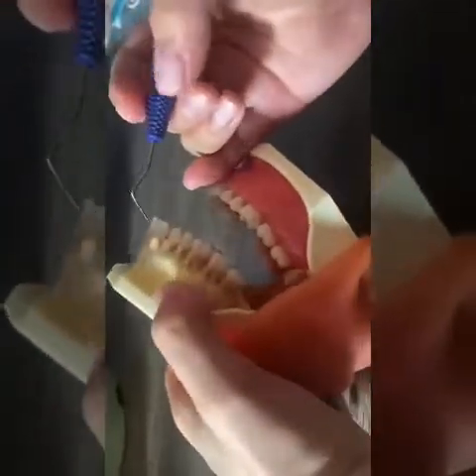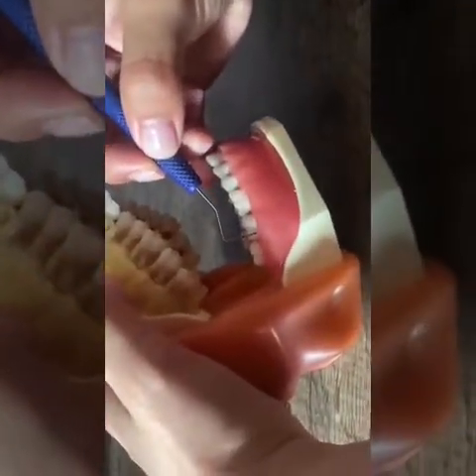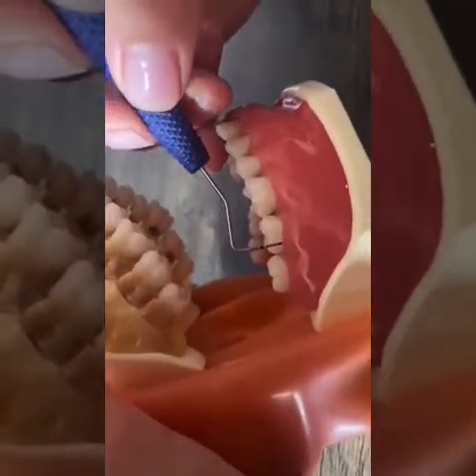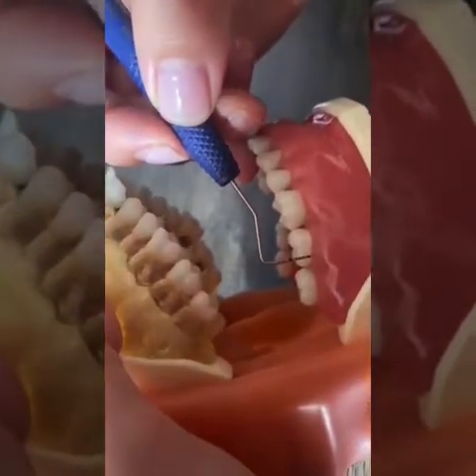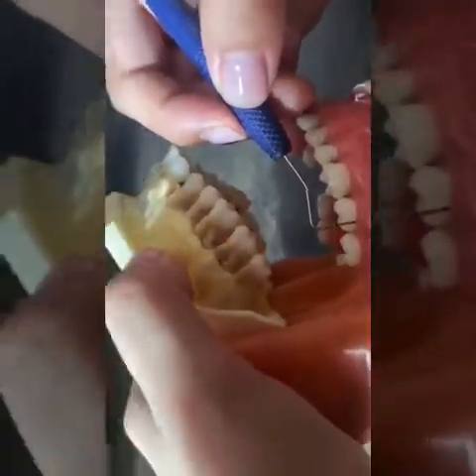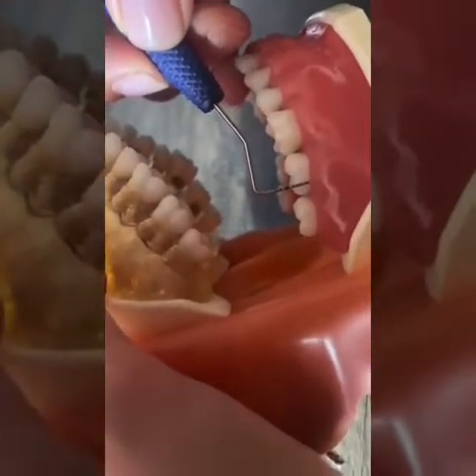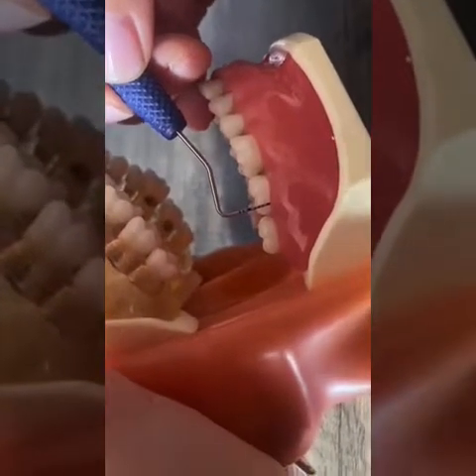So we start at the distal line angle, and we go to the bottom of the sulcus. Right here, we start right here. This is our first measurement. We go to the bottom of the sulcus. We push lightly until we see blanching of the gingival edge. Once the probe is inserted into the periodontal pocket, just like that, the working end is parallel to the root surface. The tip is flat against the root surface.